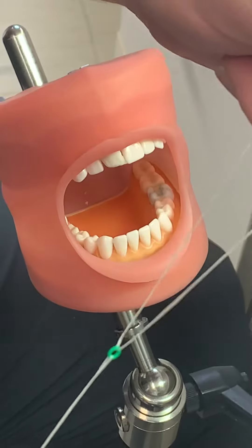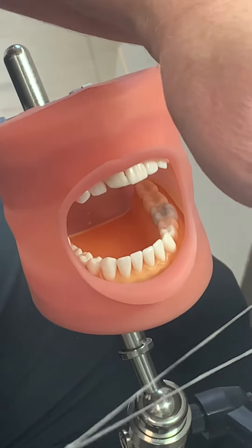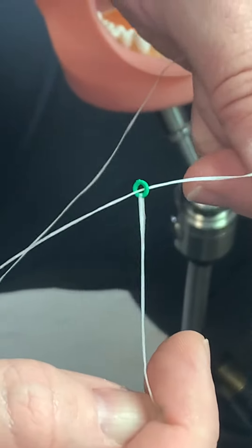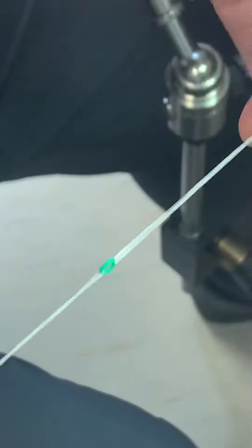We're going to place separators. Separators are placed before the bands go on the teeth — the separator is making the space for the bands to go on. First, what you want to do is loop your floss through your separator. This is a separator here, and we're going to loop floss through both sides of that so that we can expand it like this.